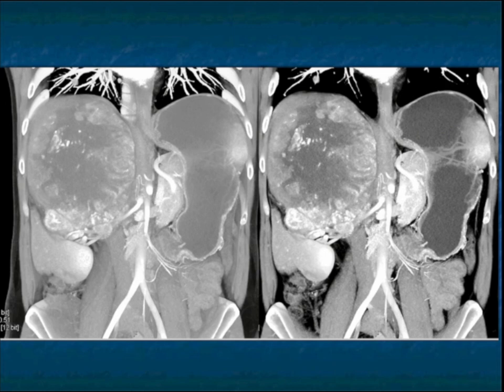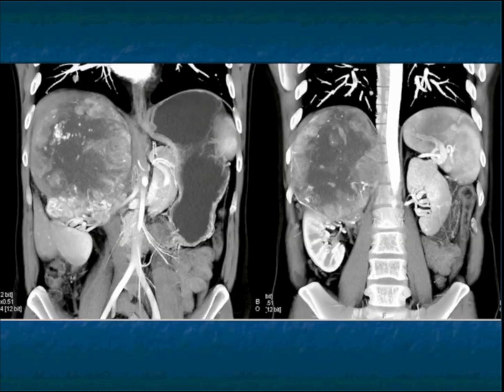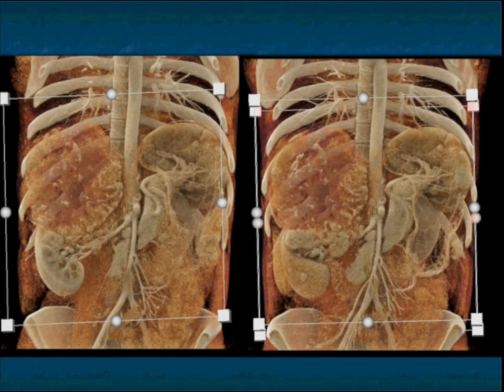You see the neovascularity. There's not much of a differential as long as you don't make the mistake of calling this a liver lesion, but I think once you've seen them, you kind of know the interface between adrenal and liver. The coronal views, the 3D in this case, is very valuable. You can see the mass pushing on the patient's renal artery. These tumors often simply compress the upper pole of the kidney even when they're very large, but occasionally they will invade, so you need to look at that carefully. And you can see the necrosis and enhancement. Primary adrenocortical carcinoma. No ifs, ands, buts, or maybes.